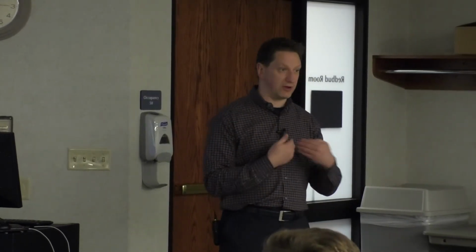Okay? My take on it, this is Garner's take. Again, do what your instructors tell you, but Garner's take, and again, I've done this more than once or twice, is if you're going to go for gusto, okay? If you gotta hurt a patient, try not to hurt them more than once, okay? They would much rather get 1 360 joule shock from you than a 100 joule shock, a 200 joule shock, a 250 joule shock, a 300 joule shock, and finally the 360 joule shock that worked, okay? Okay, very good.